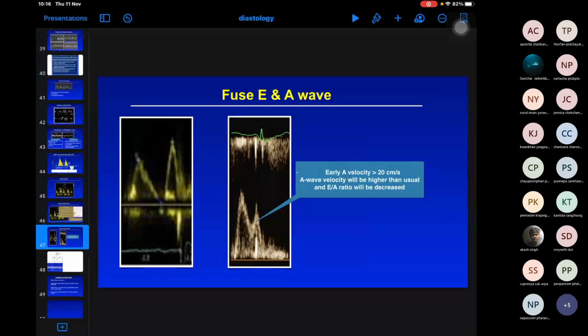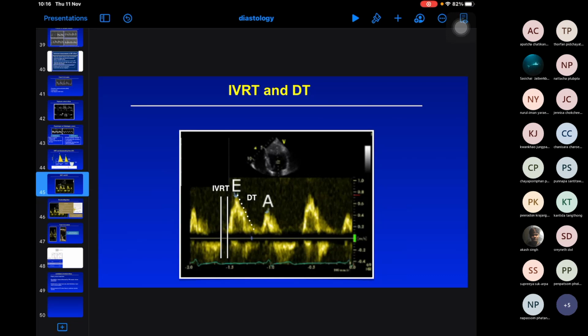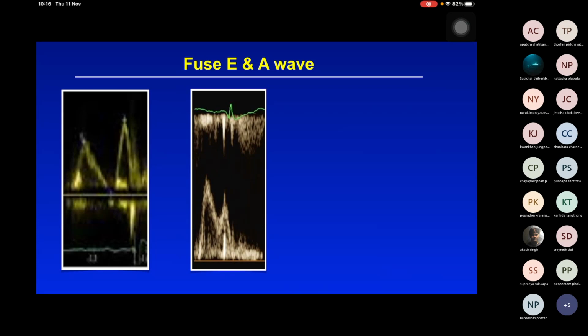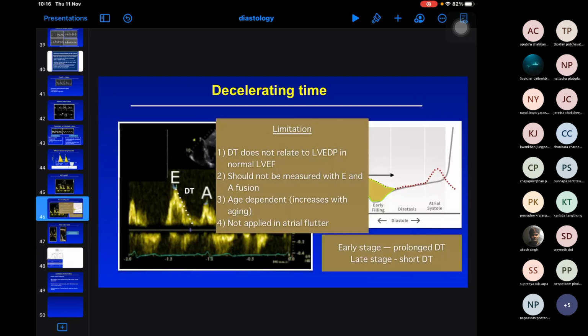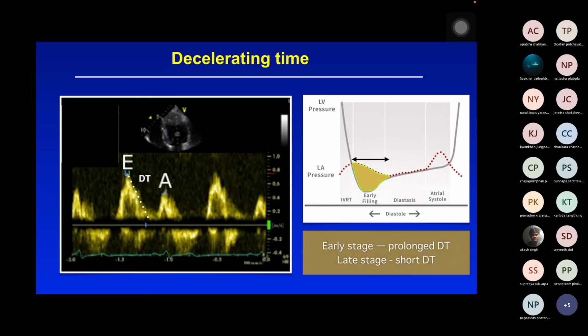Any question? You should know all of the parameters from the mitral valve inflow, and this is IVRT and DT. Okay.